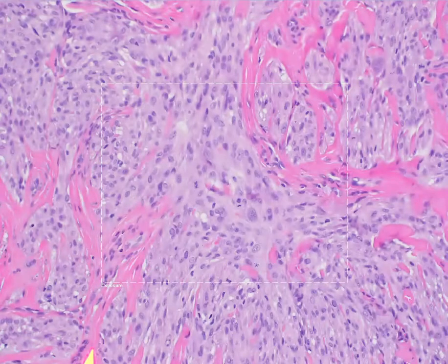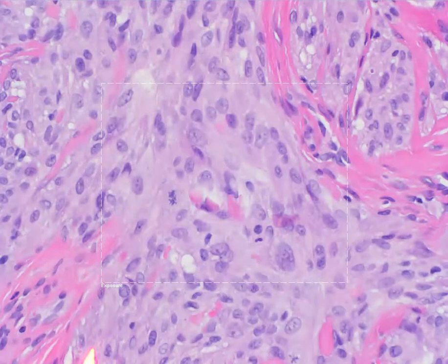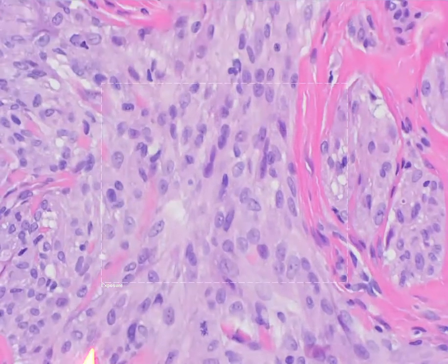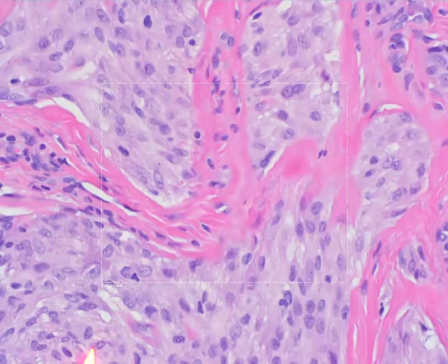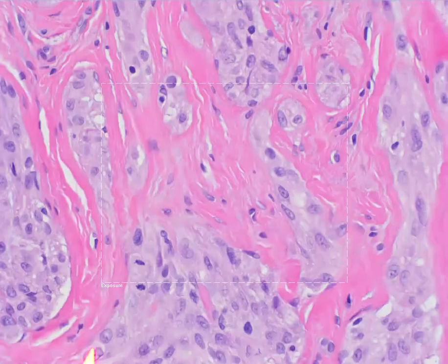And when you look on higher power, the cells have these large kind of ovoid nuclei with ample eosinophilic cytoplasm, as you can see. And not uncommon to see some mitotic activity as well.